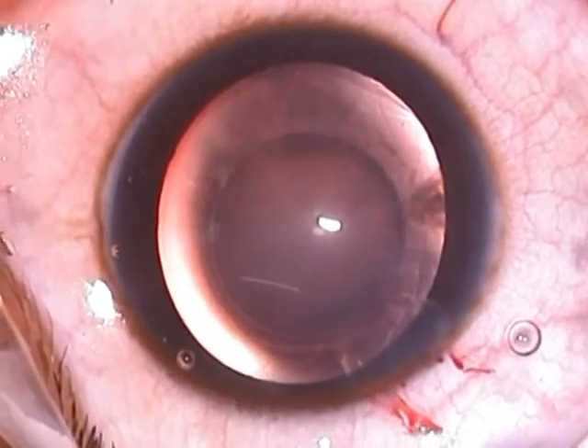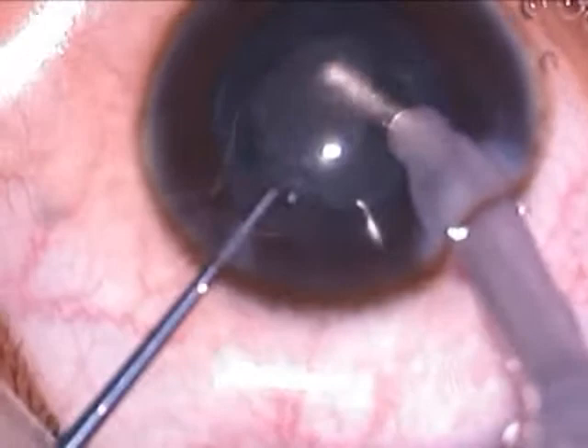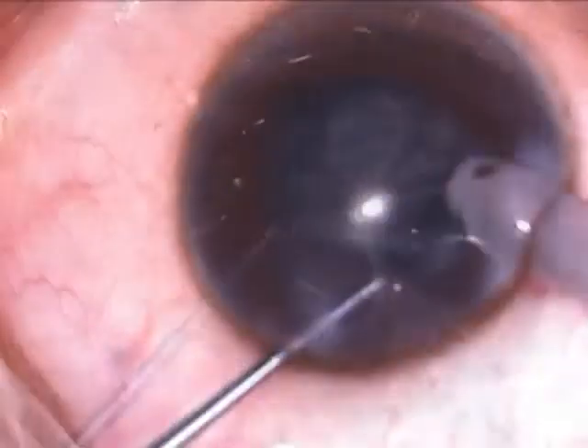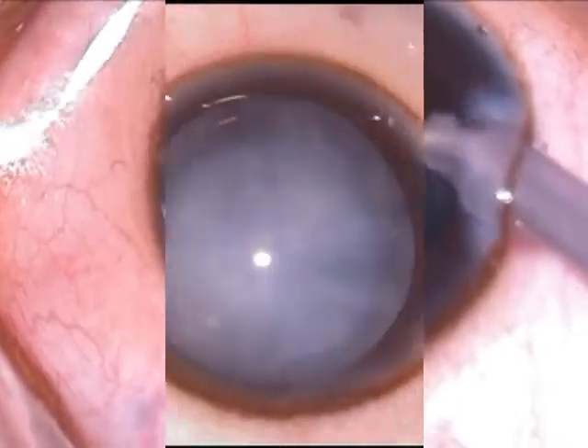This patient with a lamellar congenital cataract was managed by coaxial irrigation aspiration alone. By virtue of its softness, it almost always requires no phaco emulsification energy. Mere irrigation aspiration itself allows for complete removal of the cataract.